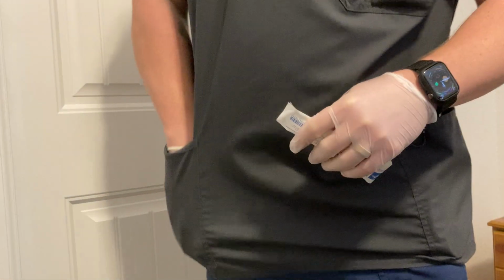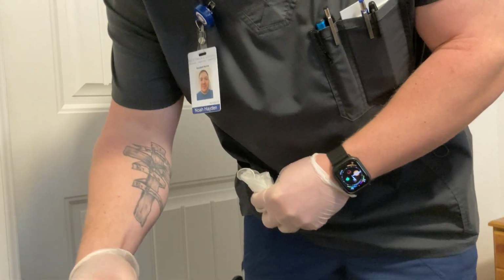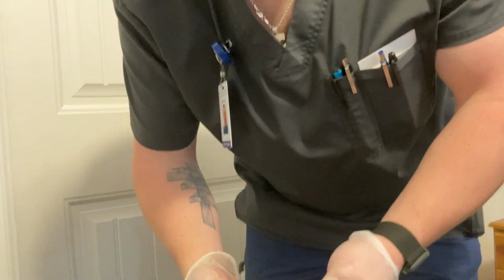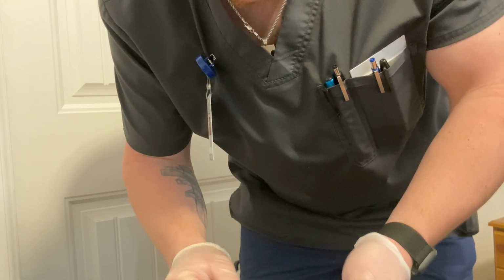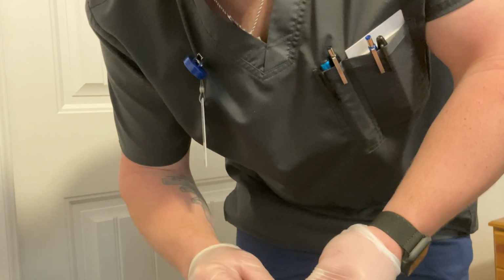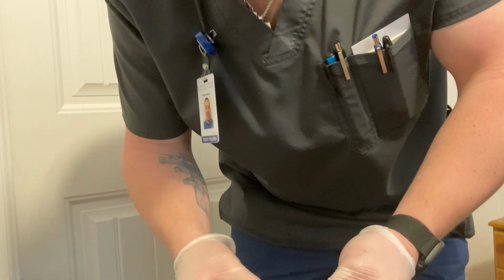I will get out the appropriate supplies. My heparin, 10,000 units per 10 mLs. Fill a syringe, and I'm going to need an injection needle and a regular syringe. I would normally grab a 3 milliliter syringe in order to withdraw 1 milliliter of solution, so that way I have enough space to relieve any air or anything that gets into my syringe that's not the medication, and also so I don't have to reach as far back on my syringe in order to inject it.